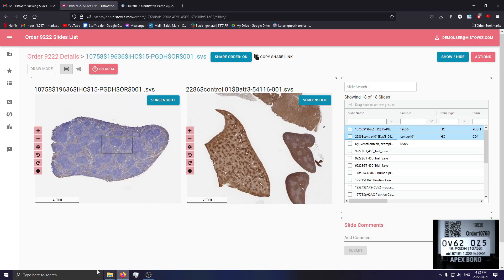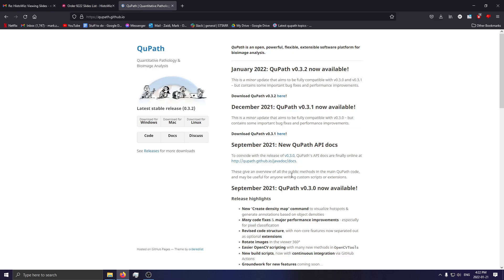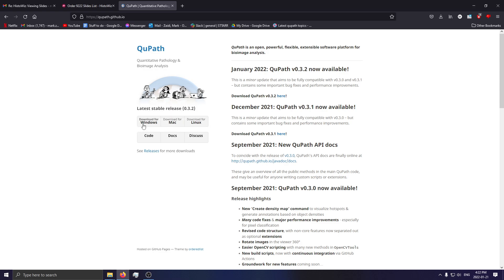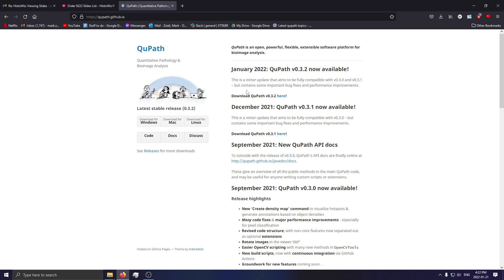After that, you will want to download and install QuPath. It's supported for Windows, Mac, and Linux. Just download the latest version and follow the installation instructions listed for each. Once QuPath is installed, the buttons and tools should be very similar regardless of what platform you use. Right now I'm using Windows 10, but if you have a Mac, it's going to be no problem at all.